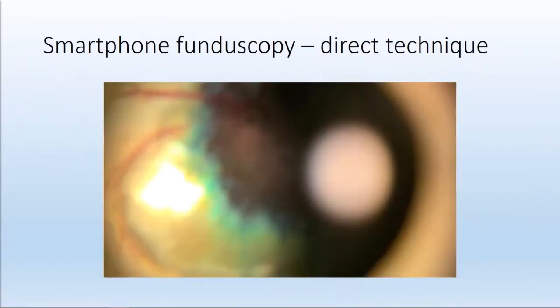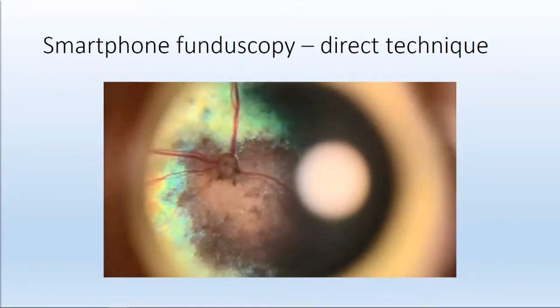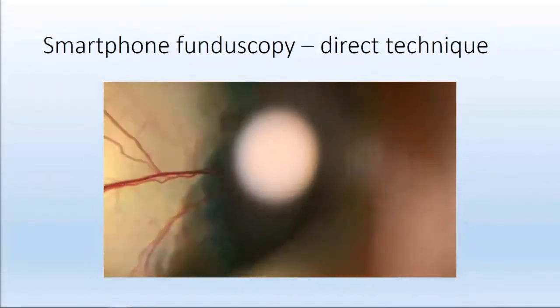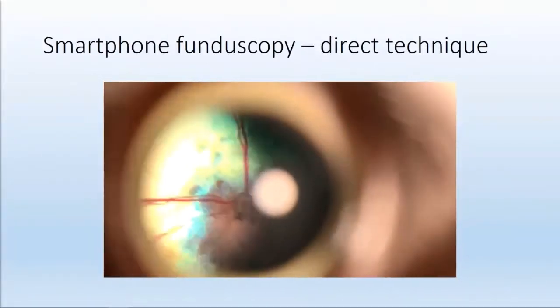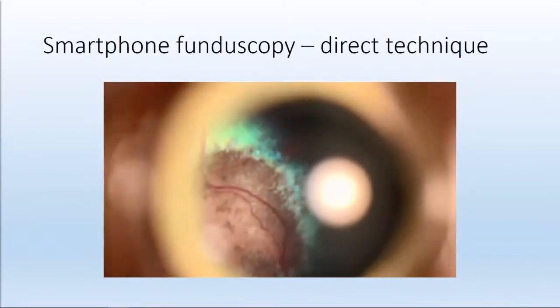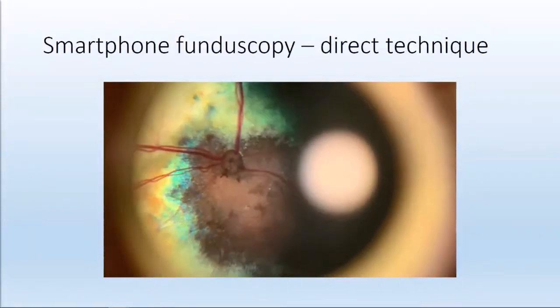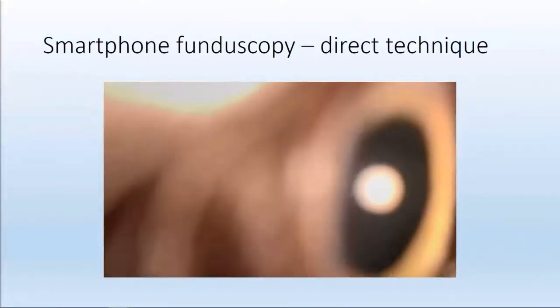This is a dilated cat, and tons of bonus points if you can name a suspicious disease that this cat has. The abnormality is the hyperreflective periphery of this massive lesion and the hyperpigmented center around the optic nerve. I didn't know what it was at the time, so it's a shot in the dark for you guys. I tested for histoplasma first because I just happened to be seeing a ton of it in Texas. But it turned out having incredibly high titers for IgM and IgG for toxoplasma.